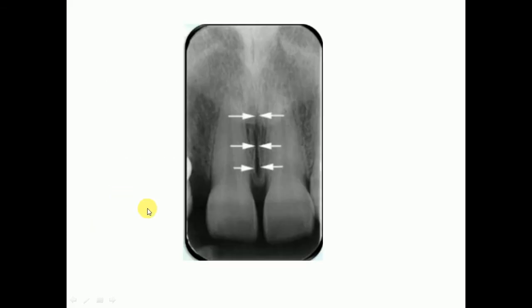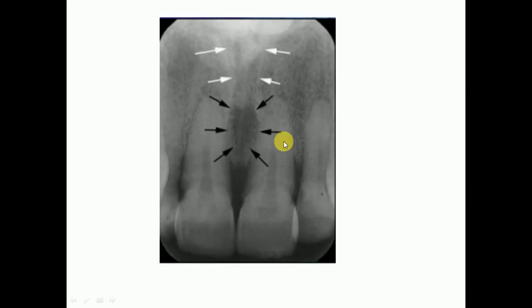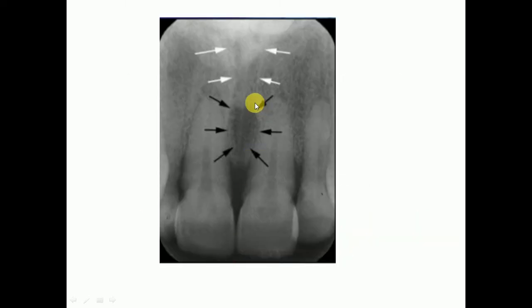Then we have the incisive foramen, also called the anterior palatine foramen. It appears as a round, oval, diamond-shaped, or heart-shaped radiolucency that is well defined on occlusal and periapical radiographs. The position of the foramen on the radiograph ranges from between the roots of the central incisors close to the alveolar ridge to the level of the apices. Variability in position is due to angulation of the X-rays.